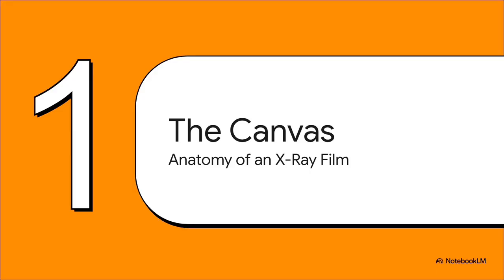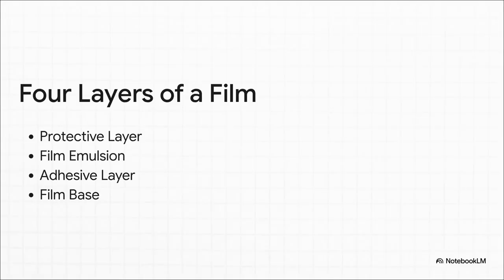it's painted on. So, what is a dental X-ray film, really? Let's break it down. The best way to think about it is like a tiny, high-tech sandwich with 4 layers. Each one has a super important job. You've got a strong film base at the bottom for support. Then there's an adhesive layer to kind of glue everything together. On top of that, you have the absolute star of the show, the film emulsion. We'll talk way more about that in a second. And then finally, there's a thin protective layer on top, just to keep the whole thing from getting scratched.